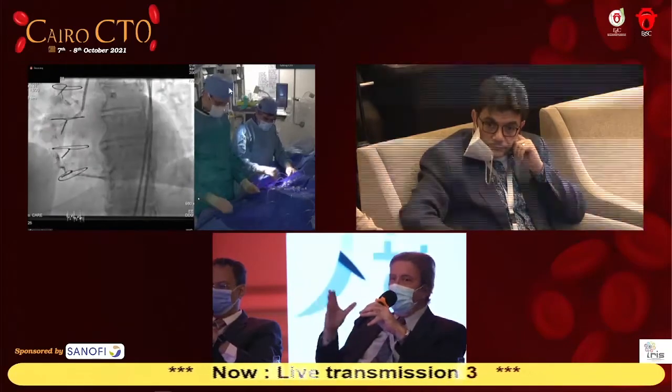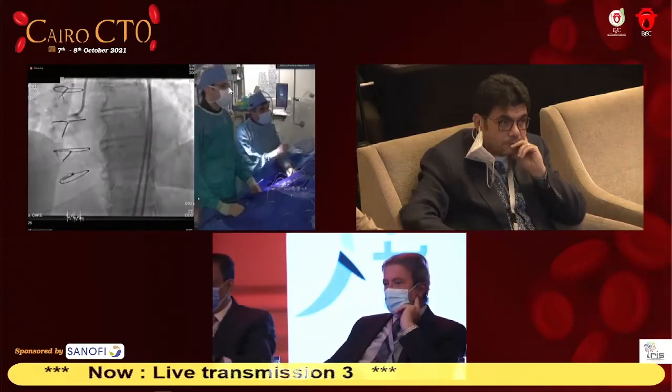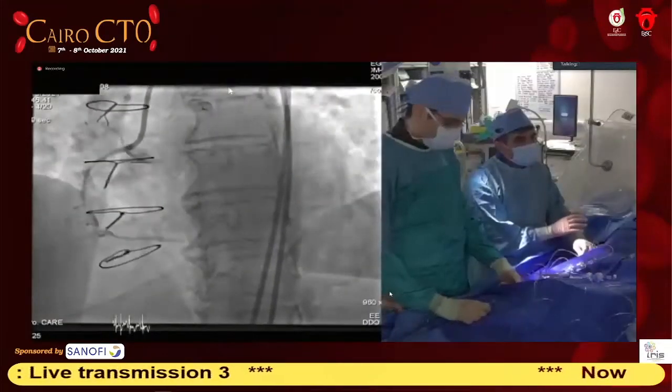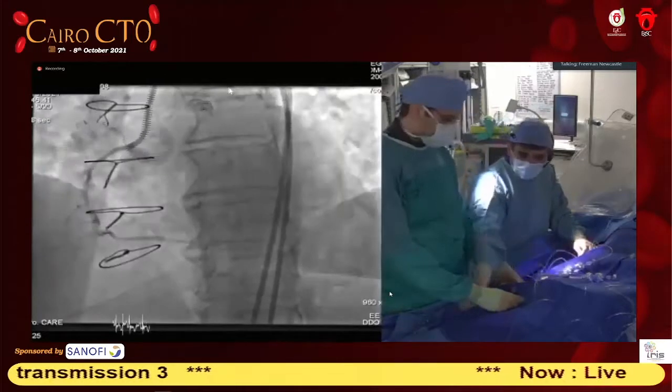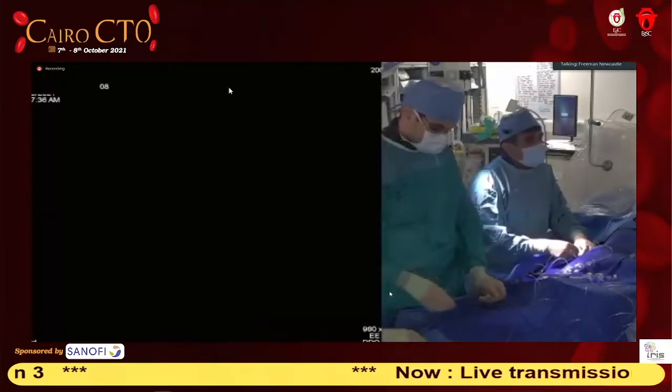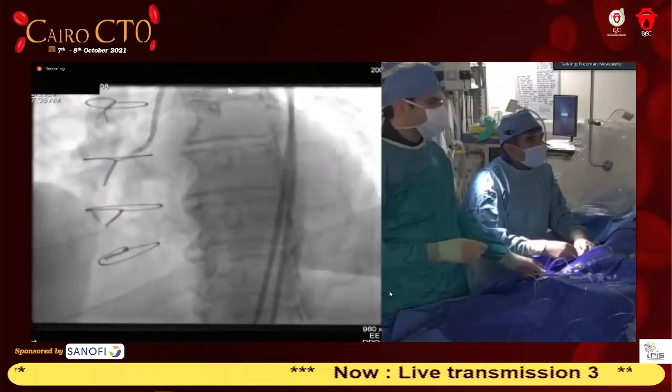Yes, I will leave it. But that's not a healthy graft, remember? I could IVUS it for you if you want, and I bet this is a 2.75 and a 4.5 graft, and it's already had a problem. So no question in my mind, and I've seen this many times before, that it will run into trouble.